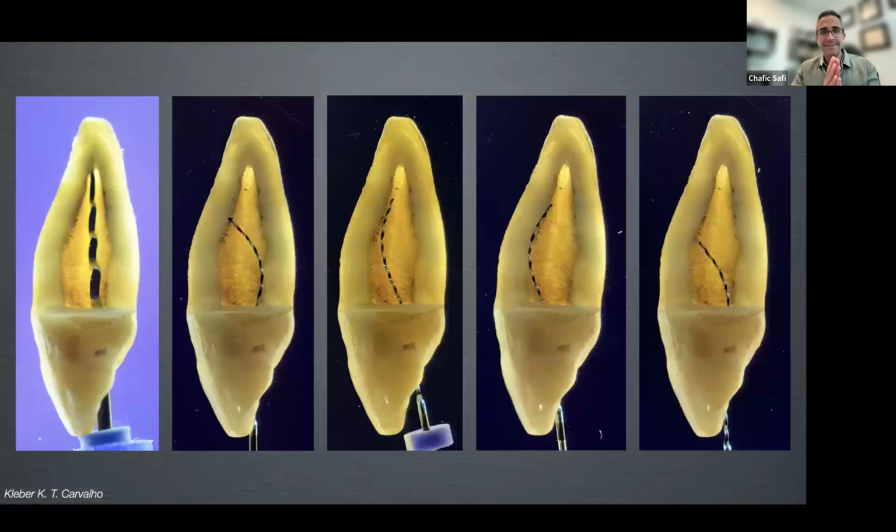If you look at this series of pictures in front of you, we can see that in a buccolingual direction, this central incisor, when you take a round file, really has a lot of areas that have been untouched. If you see on the next four pictures, we see how the action of the finisher happens when you have scrubbing with the tip of the file or just rubbing with the body of the file against the root canal wall. So we are spreading the action of the tip and of the body of the file all along the working length against the various aspects of the root canal anatomy in order to remove what's left behind.